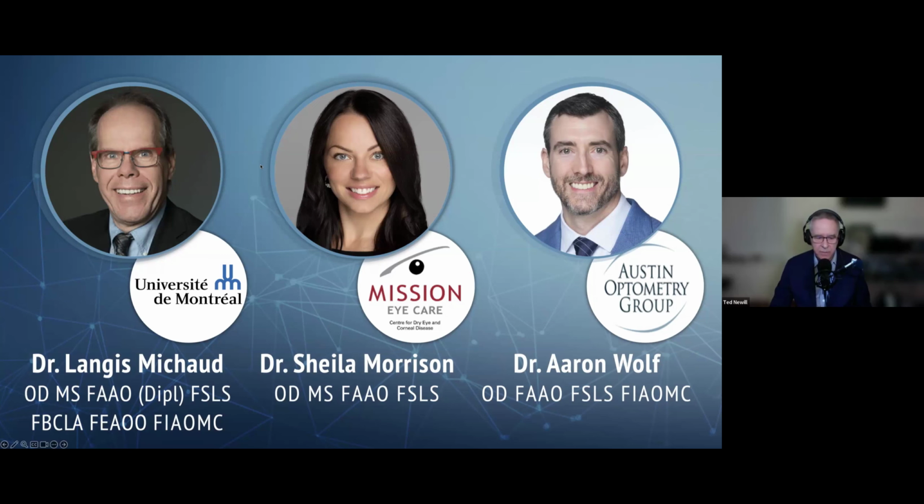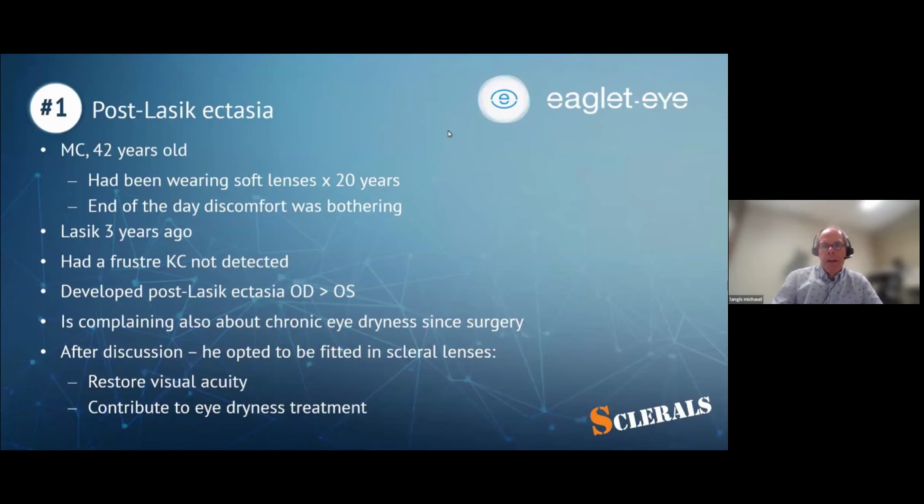Langis Michaud: Thank you, everybody, for joining this webinar about the use of eaglet as an essential tool in our clinical practice more and more when we want to fit specialty contact lenses. The first case I want to share with you concerns post-LASIK ectasia. We have a patient here of 42 years old, whom I met recently at the School of Optometry, University of Montreal.